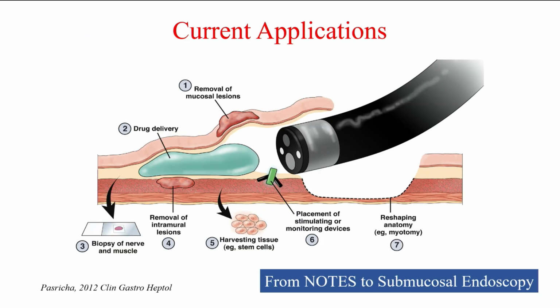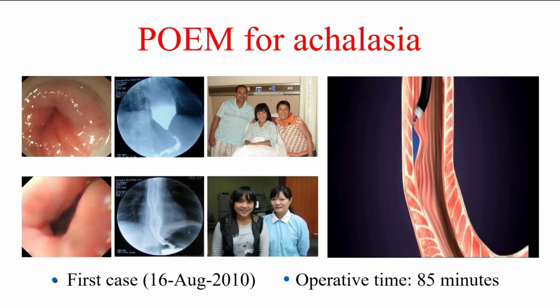The current applications of the third space, I think, first is the removal of large mucosal lesions, and the second is myotomy for achalasia. POEM for achalasia is a milestone of the third space. We first performed POEM for achalasia in Shanghai in 2010.